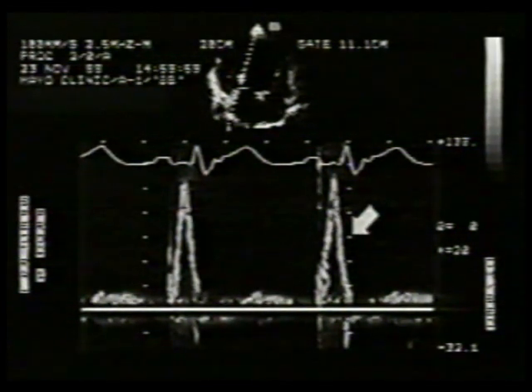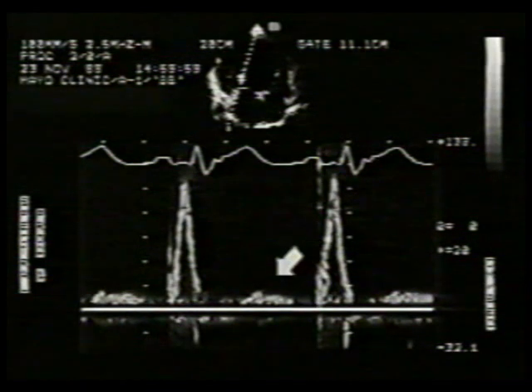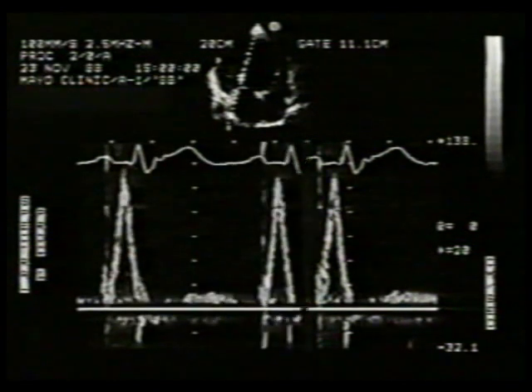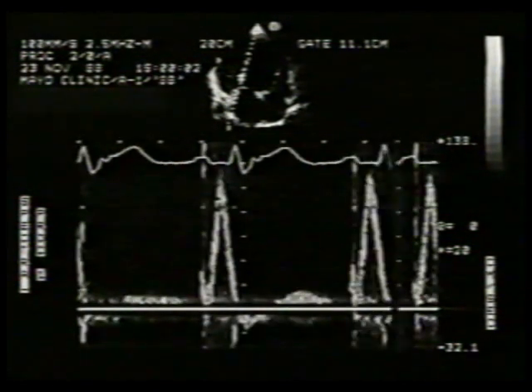This dilated cardiomyopathy patient demonstrates an exaggerated abnormal relaxation pattern. His E velocity is almost non-existent, at less than 0.2 meters per second, while his A velocity is greater than 1 meter per second.